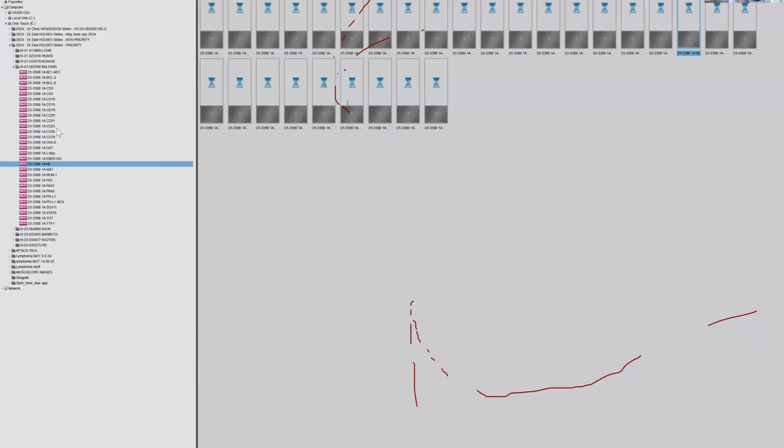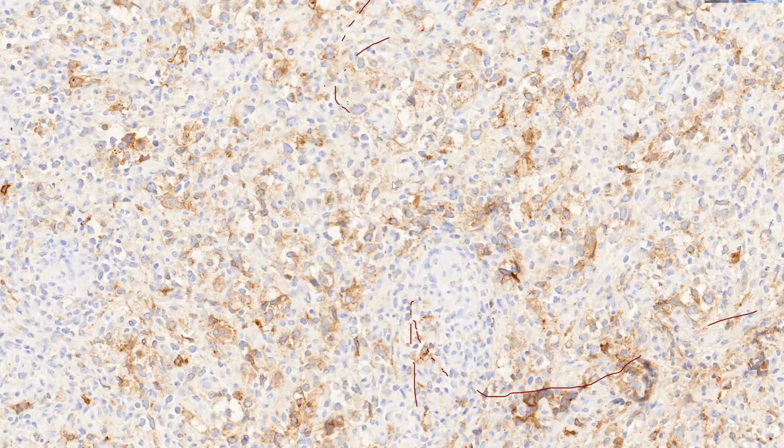And at the immunohistochemical level, they can express CD30. So you can see the expression. Again, as we said, the expression of CD30 is not consistent, it's weak, it's patchy with variable staining, mostly weak. And this case was strongly positive for CD20. So this is a primary mediastinal B-cell lymphoma. It was in a young patient. And just as an added point, the PD-L1 expression is very strong in such cases, which is an added desirable criterion to diagnose this entity.